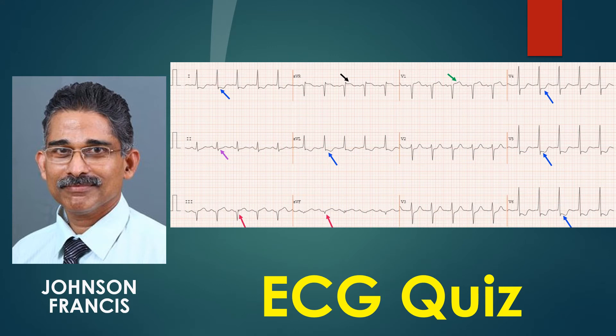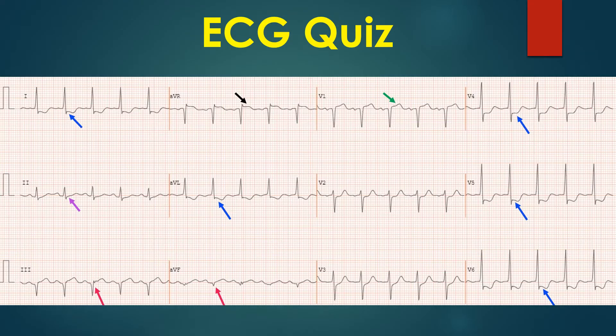What are the salient findings on this ECG? In addition to sinus tachycardia, ST depression is noted in lateral leads 1, AVL, V4 to V6, marked by blue arrows.